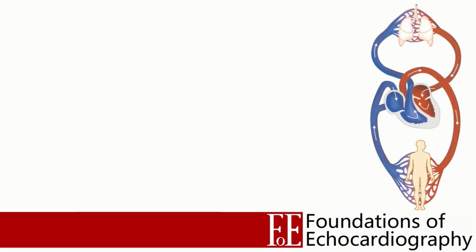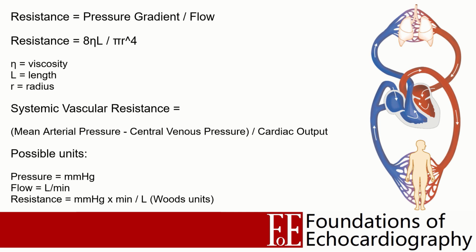In critical care, it's common for us to describe the resistance across a large portion of the circulation in order to help understand how the body is responding during states of critical illness. For example, we can use cardiac output monitoring devices to estimate the cardiac output, and use invasive catheters to measure the mean arterial pressure and central venous pressure, which gives us our pressure gradient. When the pressure drop across the non-pulmonary component of the circulation is known, we can calculate the systemic vascular resistance, which is the composite resistance across all of the non-pulmonary blood vessels.